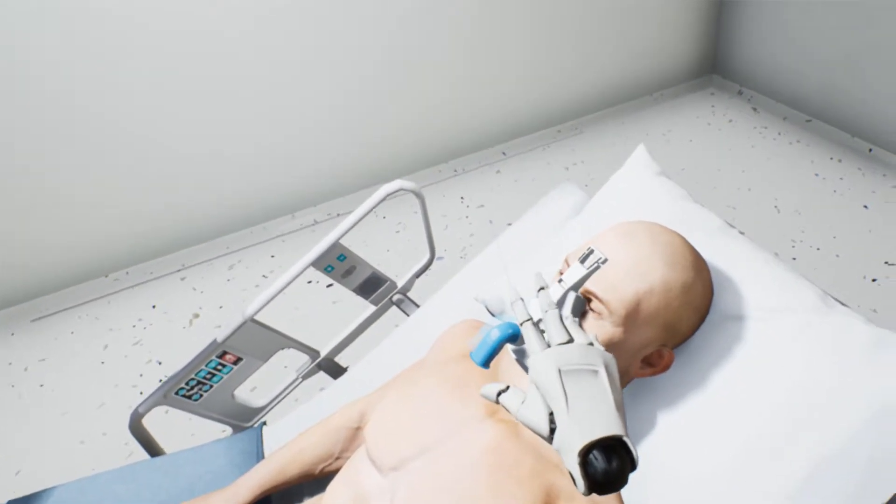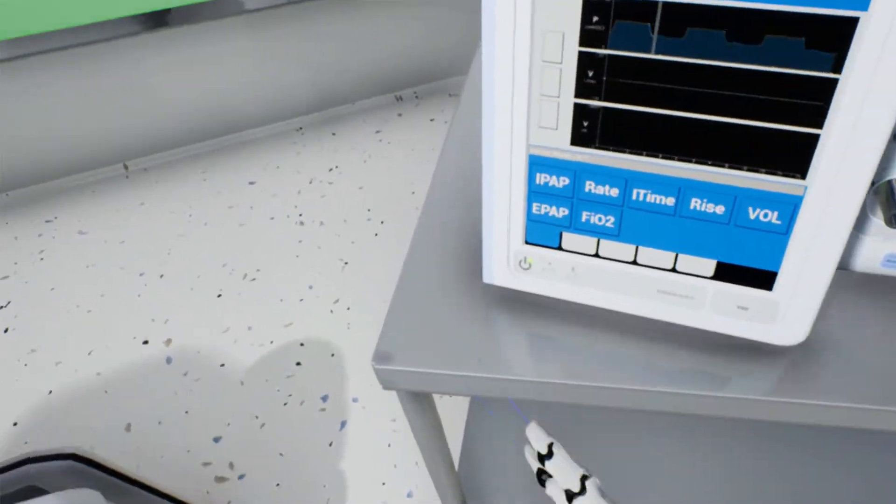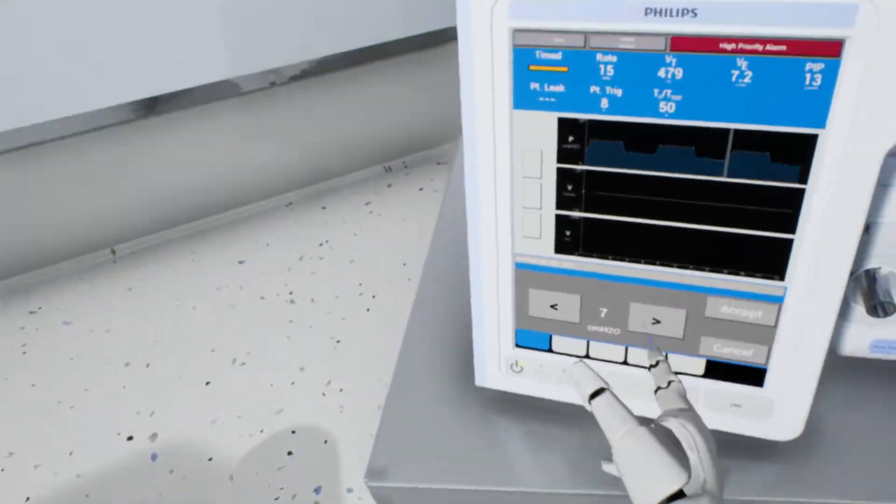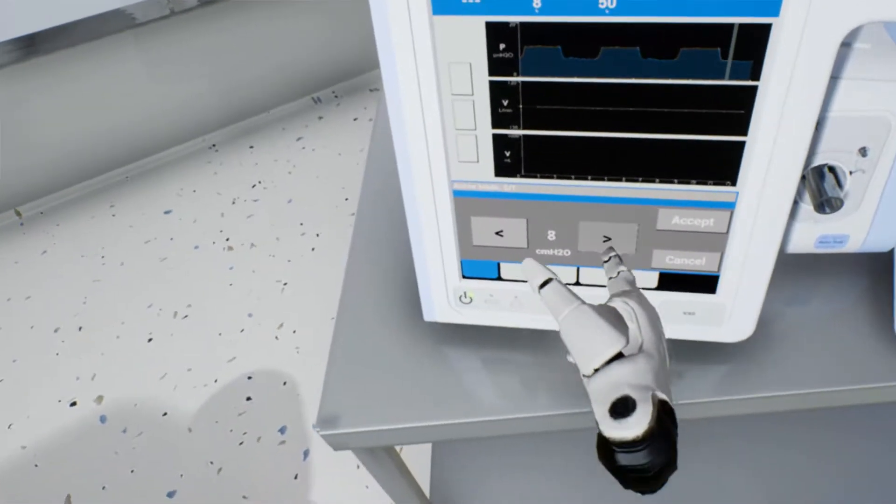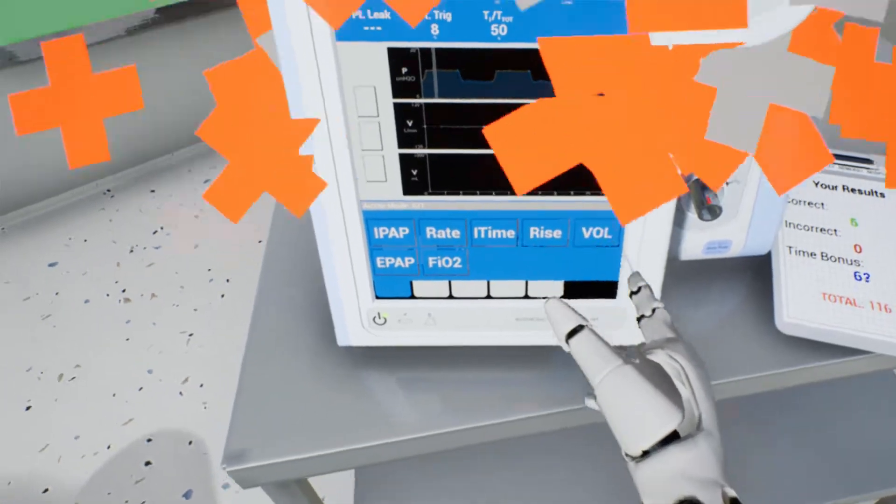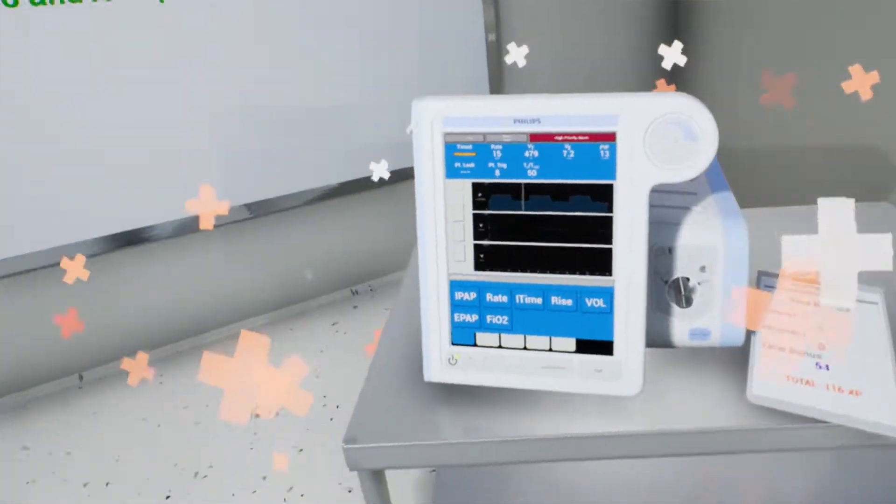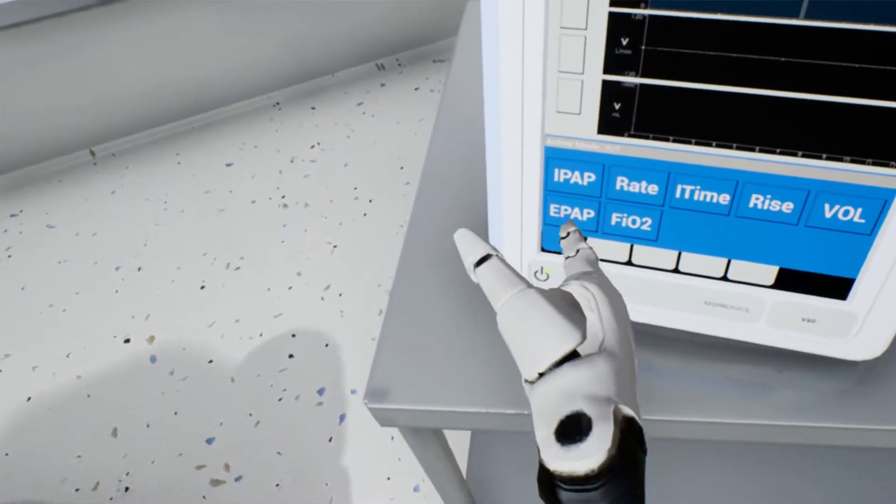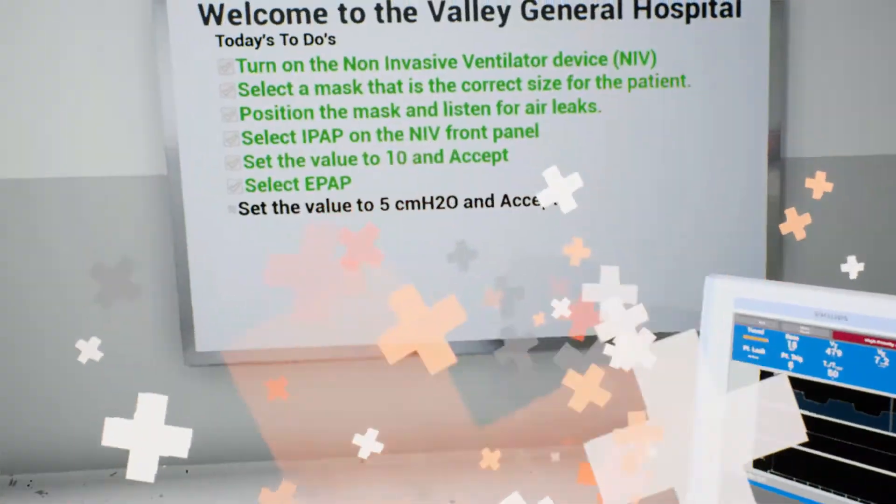Good. Select IPAP. Excellent. Change the setting to 10. Good work. Select EPAP. Good. Change the setting to 5.